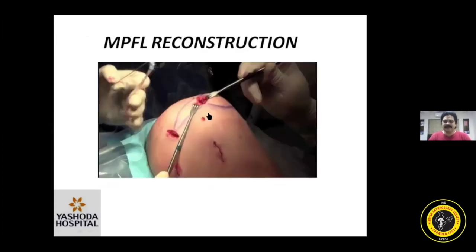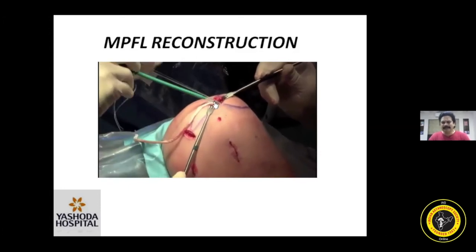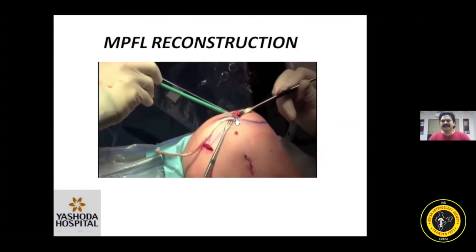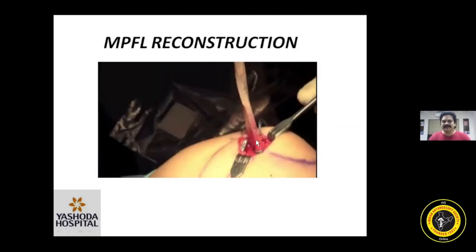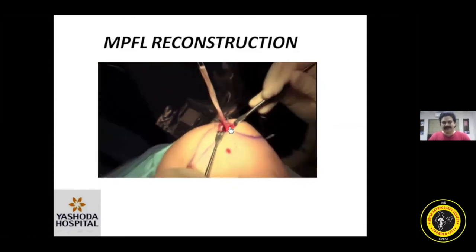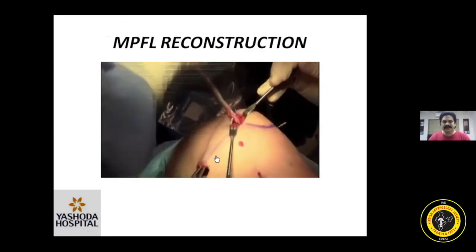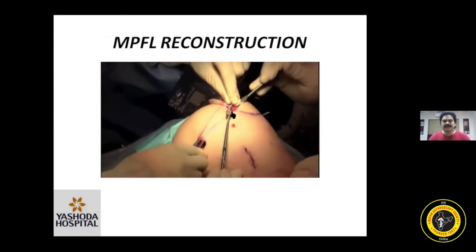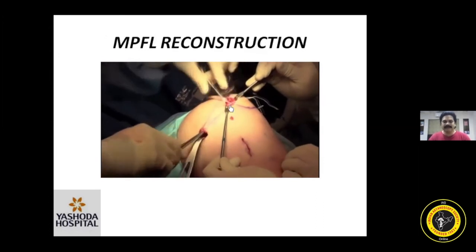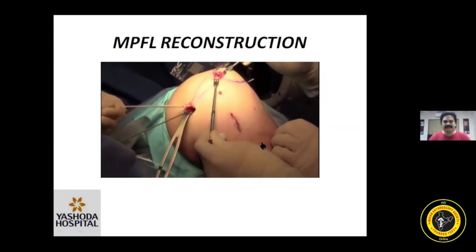First, we fix the graft on the patellar side with the knee in flexion using a simple swivel lock — both limbs of the graft are kept on the patellar side. Having done that, we pass the graft extra-capsularly under the subcutaneous tissue on the medial side. Under arthroscopic guidance if necessary, the hemostat is passed and the lead sutures are pulled subcutaneously, completing the MPFL graft passage.